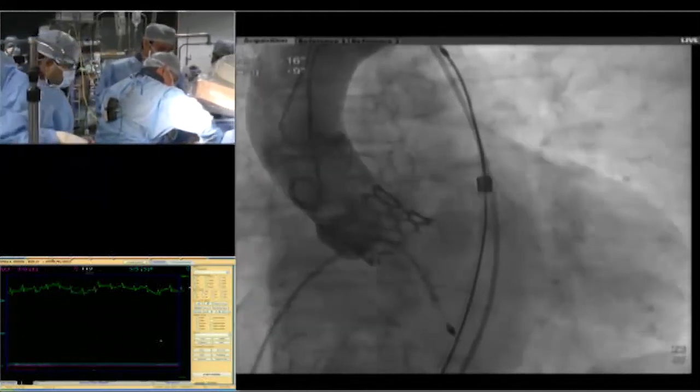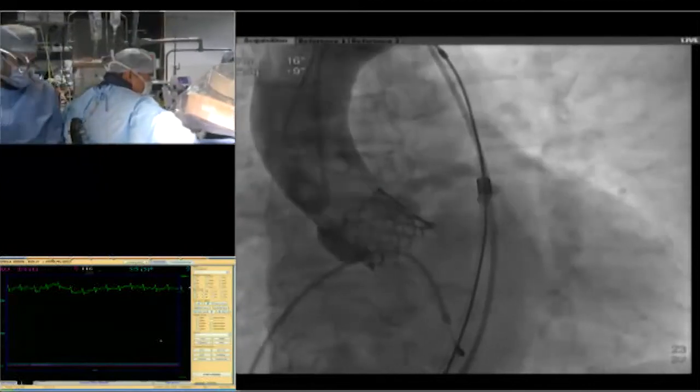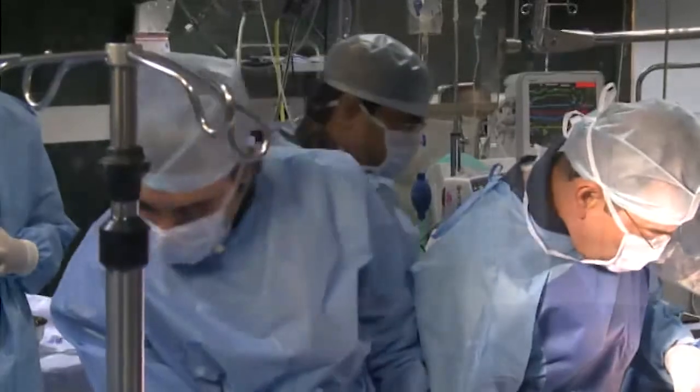There's a hematoma. So what we do is somebody can just see what's happening. I want some focus pressure on that. You will close it. 18 French groin. Hematoma, big hematoma.